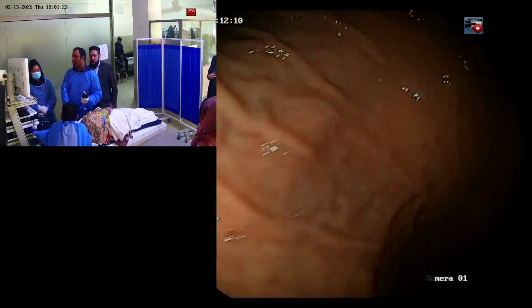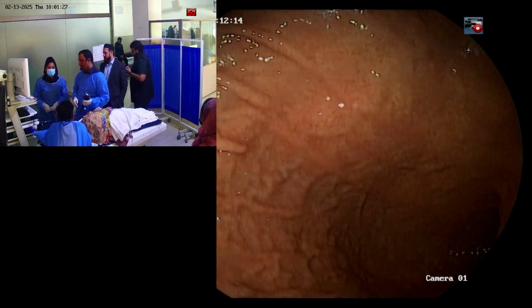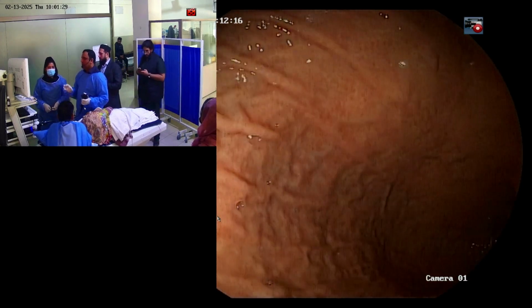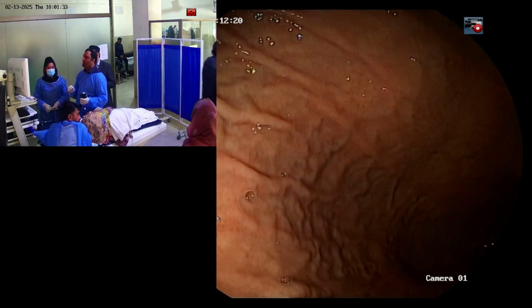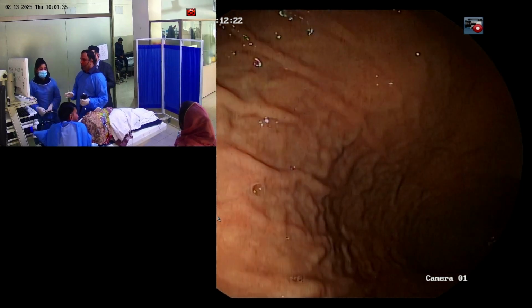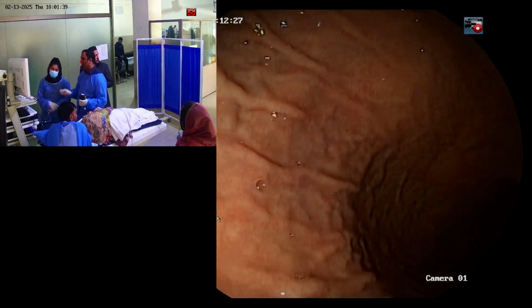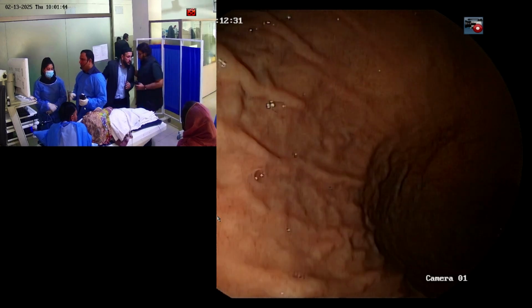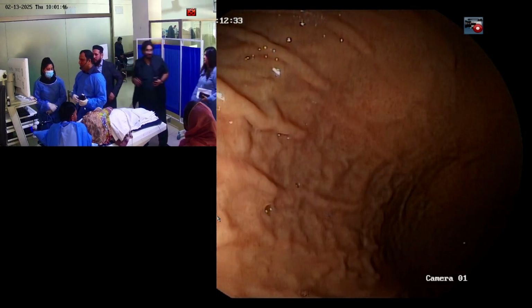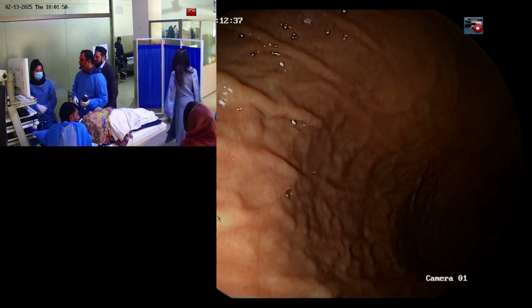Dr. Shafqat, are you going to prime your needle beforehand? And what are you using for priming, if you are doing it? Yeah, before, and what we will be injecting afterwards, to extrude the glue in the channel. Before proceeding with the histoacryl injection, it's very important that you do a drill, especially if your tech is not doing daily procedures with you.